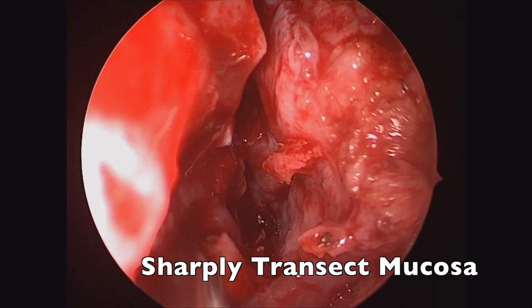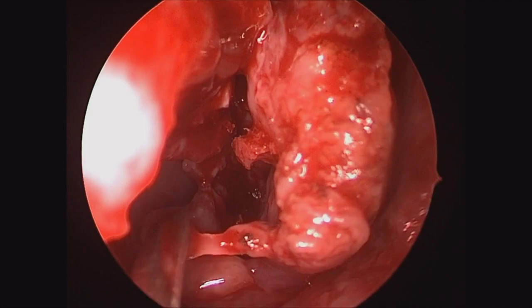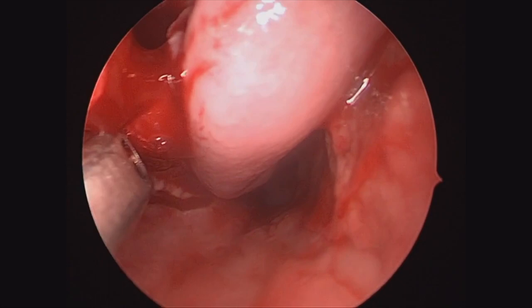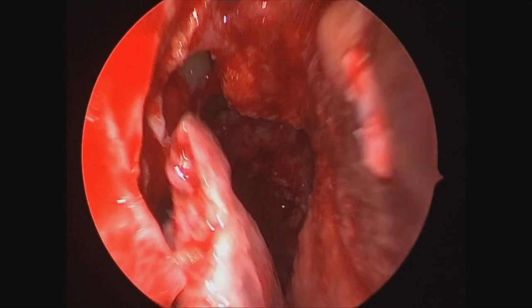Then we'll come across that sharply with some scissors as we work posteriorly. One thing to note is that the inferior turbinate flap has a relatively limited reach compared to the nasal septal flap, and it has a little bit of a limitation in the posterior aspect. So I like to do a releasing incision on the inferior aspect as well to allow it to rotate a little bit more freely and cover these higher clival defects. You have to make sure that you don't compromise your pedicle or arterial blood supply, but that releasing incision can really help to mobilize the rotatability of this flap.